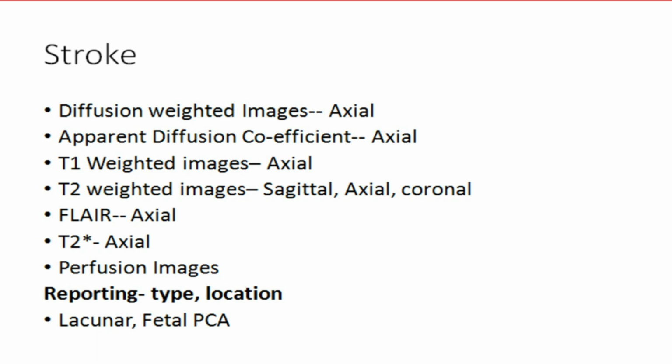Perfusion images are done as part of the protocol. It's not routinely done even in stroke patients, depending on the center. So what we were doing in the US was CT perfusion images. But there are MR perfusion images you can do. You need the software, you need the people who can interpret it. Again, this is very helpful to time stroke and to give acute treatment for stroke. I hope many of you know that the treatment for stroke involves giving TPA in the first 4.5 hours, just like cardiology patients, and it really saves them.